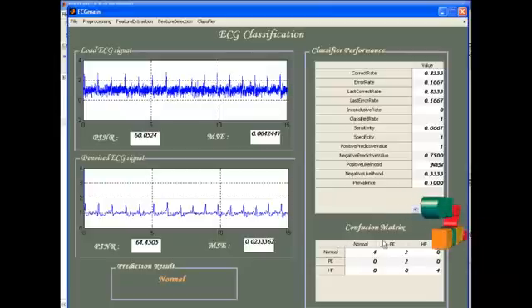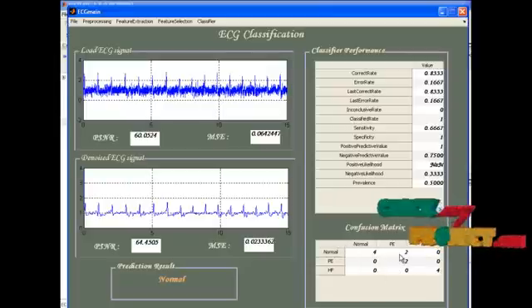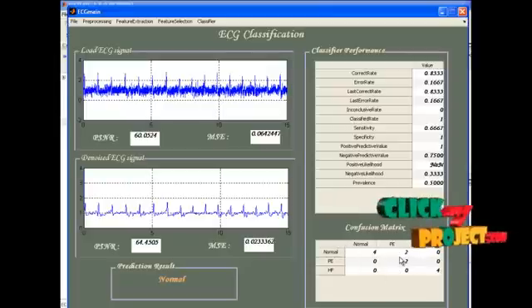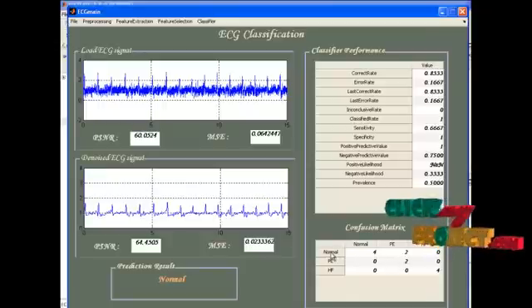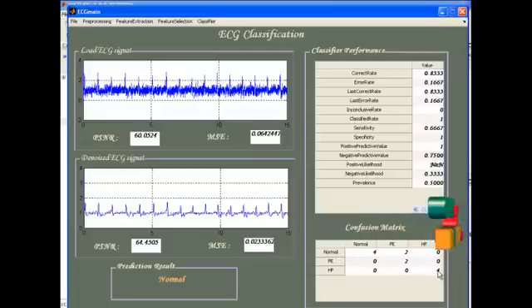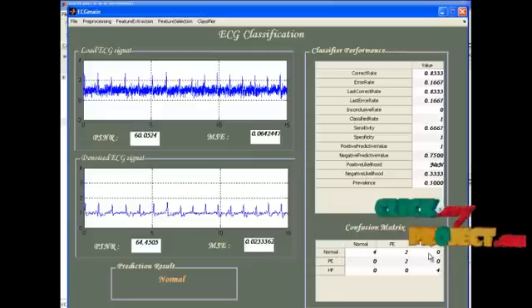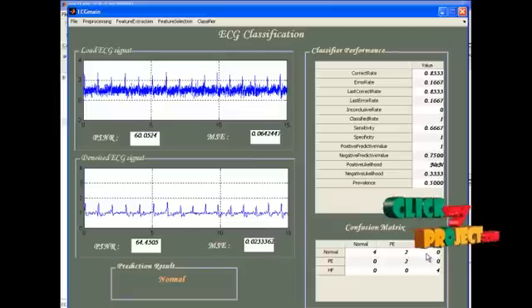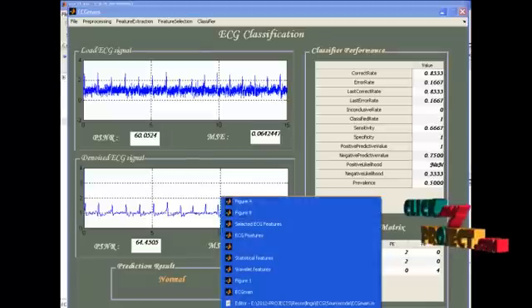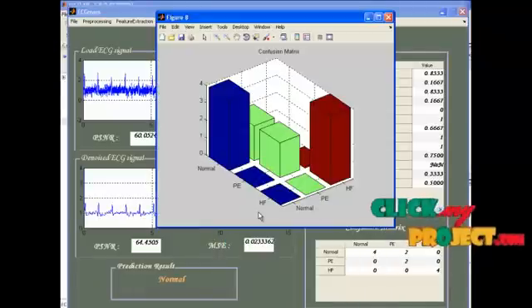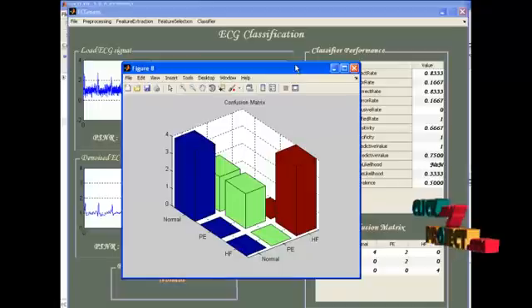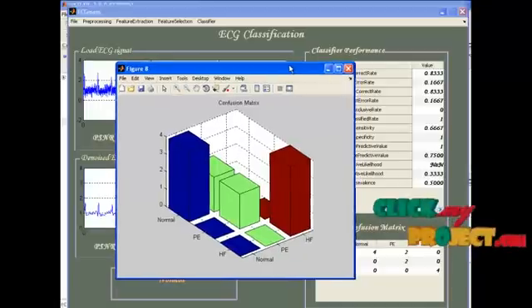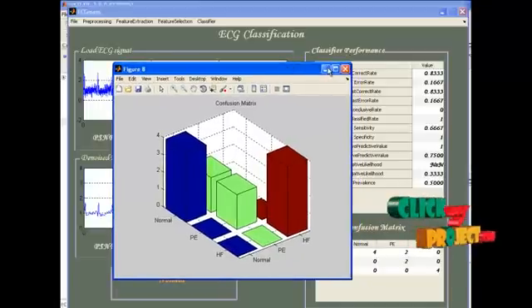And this one is the confusion matrix showing how far our classification yields the best performance. The diagonal elements show the correct classification. Other than diagonal, it shows the misclassification. Now, we can see the bar chart representation also. This is the 3D bar chart representation for the equivalent confusion matrix.